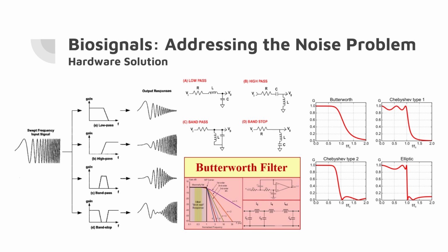Another thing to think about is that bandpass filters are basically a combination of a high-pass and a low-pass filter, and a band stop is basically the opposite of that. Instead, you're removing things in a specific region of your signal between one frequency and another. There are a couple of different types of filters, but some of the more commonly known ones are Butterworth, Chebyshev, and elliptic. Effectively, Butterworth is a maximally flat response.